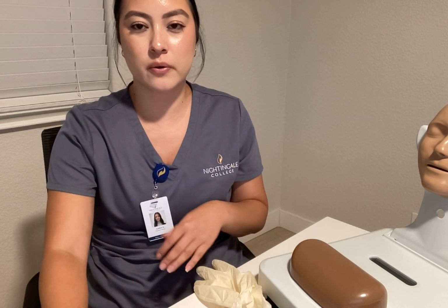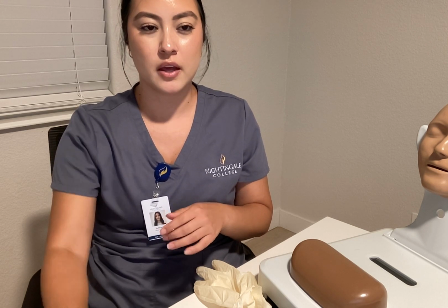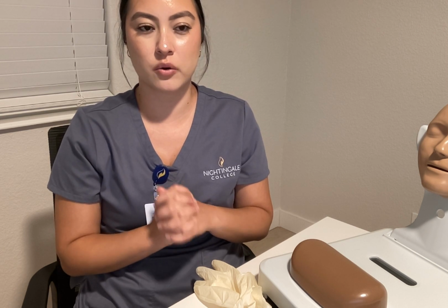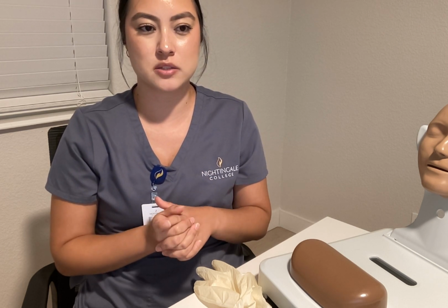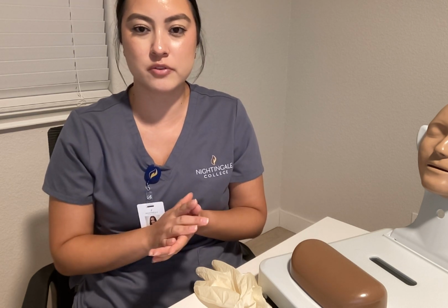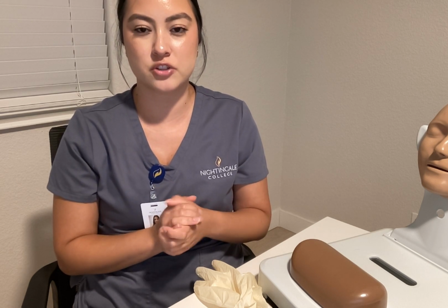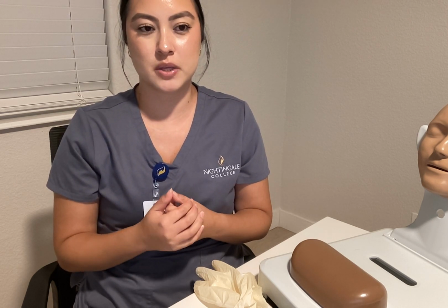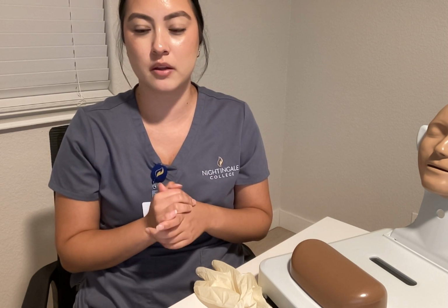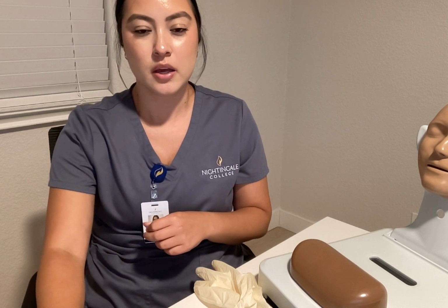The medication that we're going to be administering today is morphine sulfate. It's 6 milligrams IM for 1 dose is our order. What we have on hand is morphine sulfate 4 milligrams per ml. We do have to do dosage calculation to get the correct milliliters for the injection. How I would get this would be 6 milligrams divided by 4, which gives us 1.5 milliliters that we are going to be drawing up and injecting for our patient.